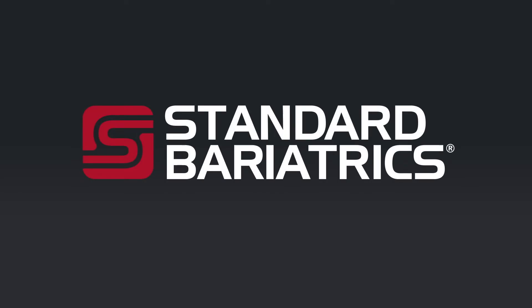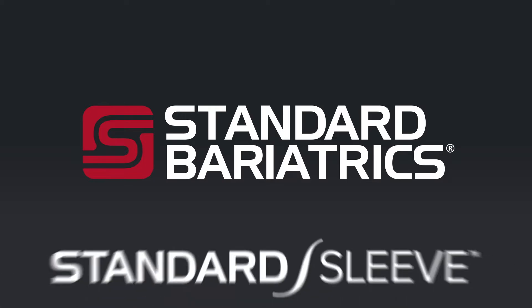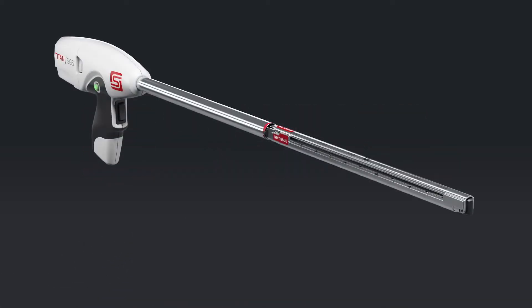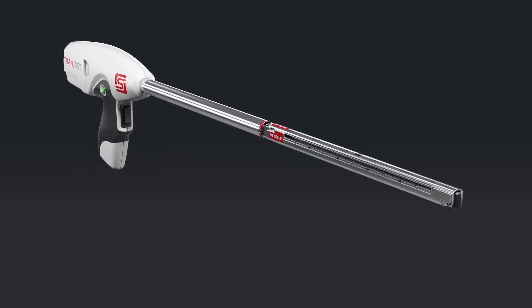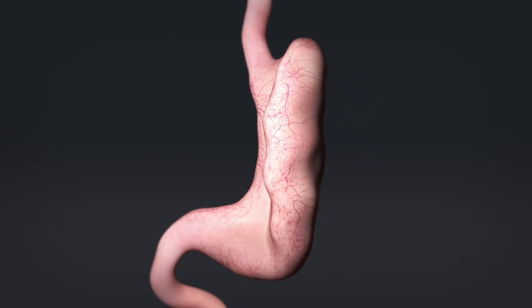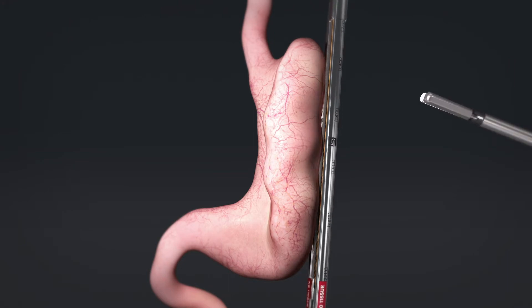There is a better and more consistent way to perform sleeve gastrectomy. We call it the standard sleeve. It's an anatomy-based approach using a purpose-built Titan SGS stapler. Insert the standard bariatrics conical shape incisura angularis protecting sizing bougie, or any sizing bougie, to serve as the guide for placing the Titan SGS stapler precisely in alignment with the key anatomical landmarks.